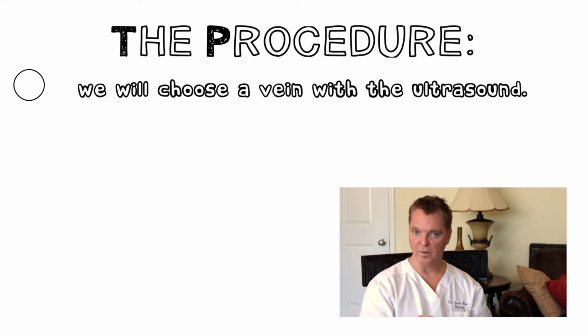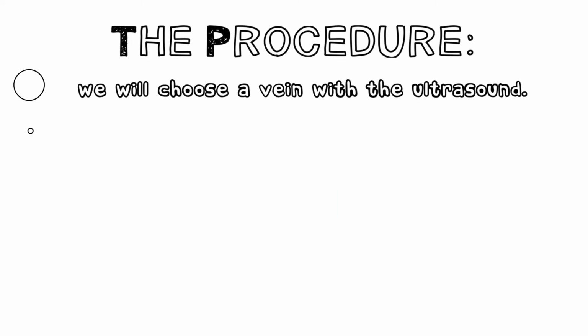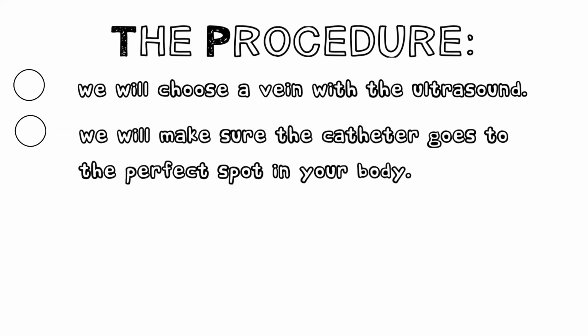After getting the needle in the perfect spot, we'll take a wire and put it through that needle. We'll take the needle out and we'll put the catheter over that wire. After we put the catheter over the wire, then we'll use an x-ray machine that will come across over your chest, and we'll watch the catheter go down to the perfect spot inside your body. Once we find the perfect spot for that catheter to be placed, we'll take the wire out, we'll suture it up right here, and then that'll be the end of the procedure.